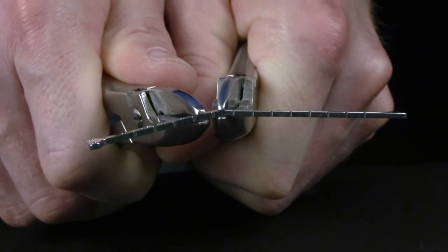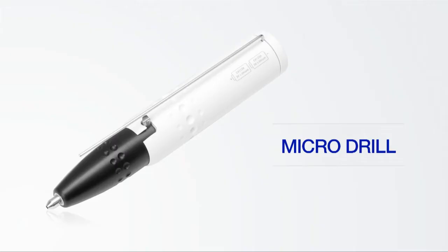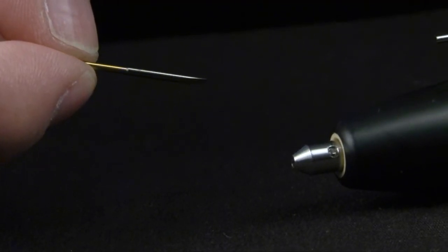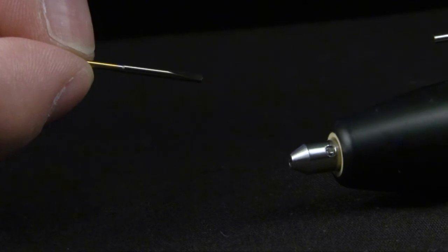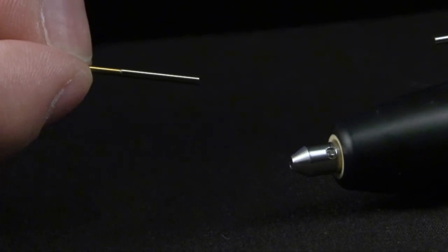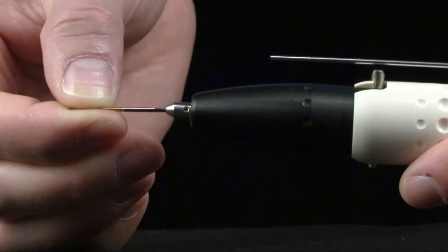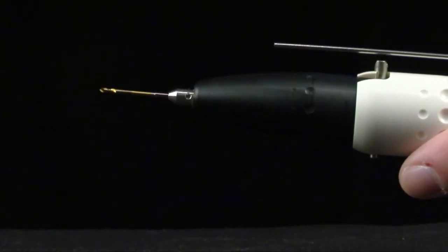The micro drill is an autoclaveable battery-operated drill featuring a tapered quick couple designed to function with the tapered shafts of the VetKISS 1.5 millimeter shaft drill bits. This drill allows precise control of the alignment of the drill bit and provides tactile feedback.